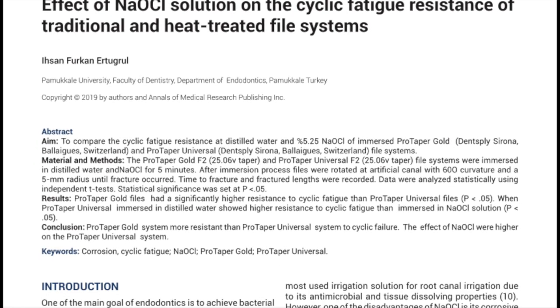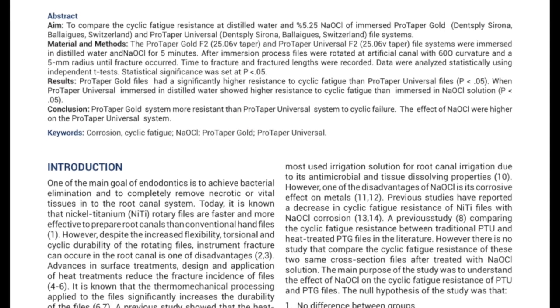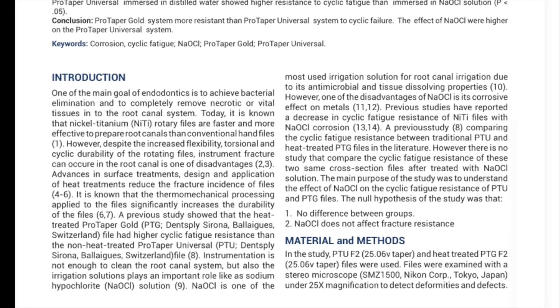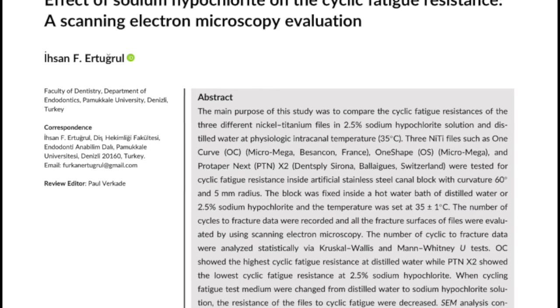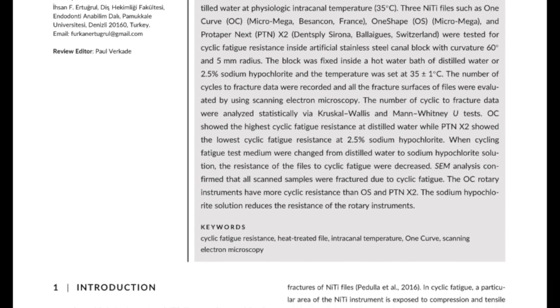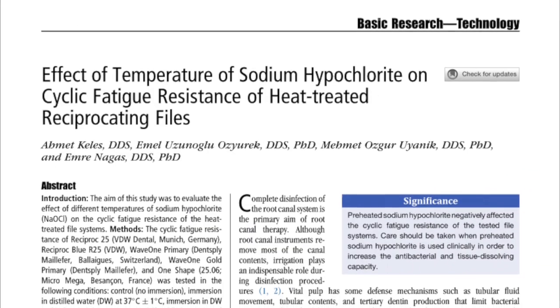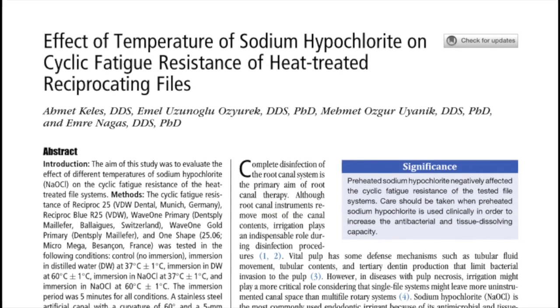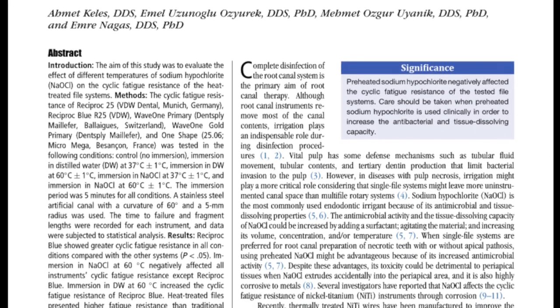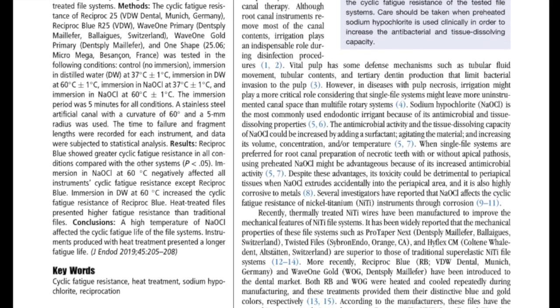Sodium hypochlorite is a highly alkaline solution and has been shown to cause measurable corrosion at a concentration of 5.25% on both stainless steel and nickel-titanium files. The effect of corrosion on files has been discussed in the literature, as sodium hypochlorite selectively removes nickel from the instrument surface. Immersion in sodium hypochlorite leads to micropitting, which negatively affects the physical and mechanical properties of nickel-titanium files.